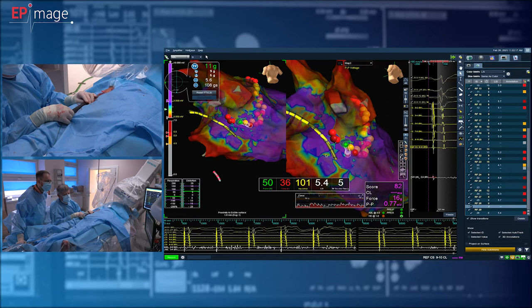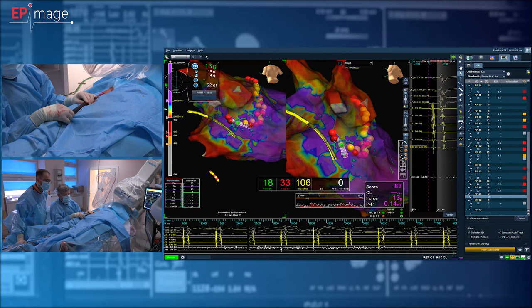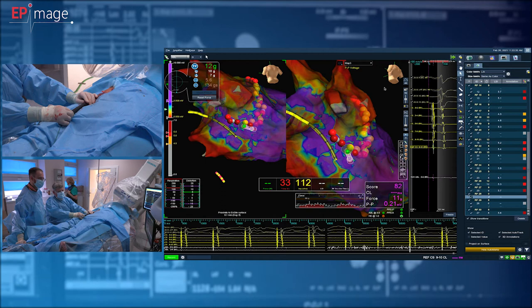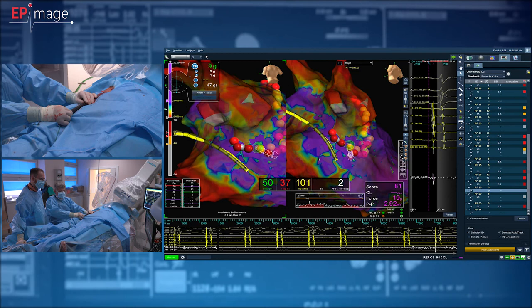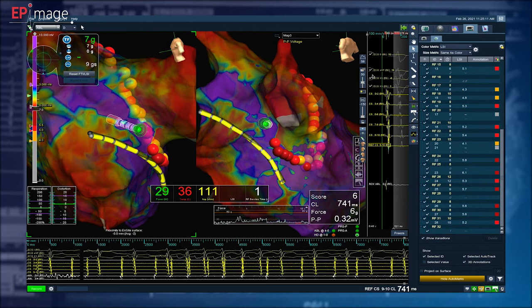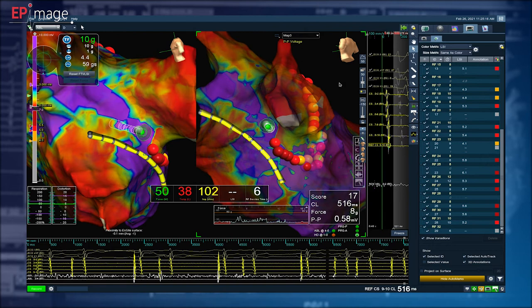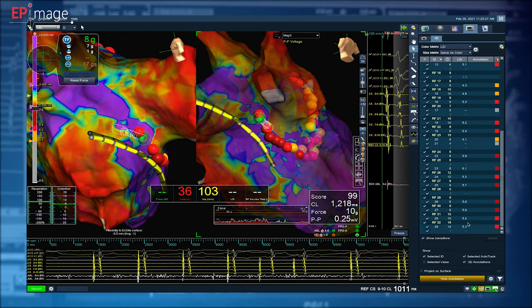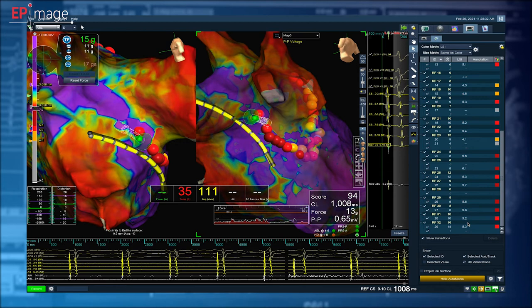On the other hand, the shallowness of this lesion is some kind of safety margin, especially on the posterior wall, when we do not want to overheat the esophagus. So from our observation and from observation of other authors who measured temperature in the esophagus during radio frequency applications, high power ablation decreases the number of temperature alarms on the esophageal probe in all of those who measure this temperature.